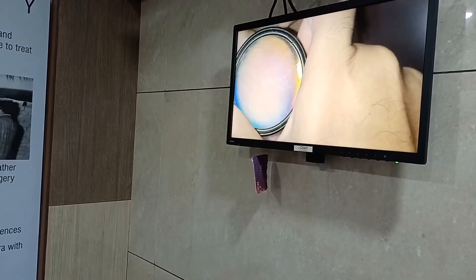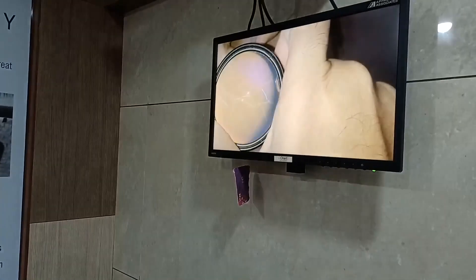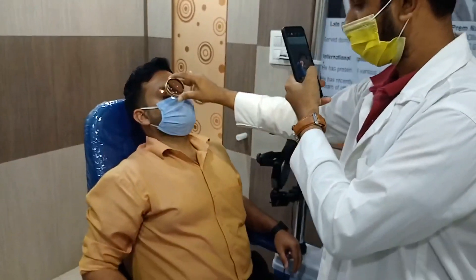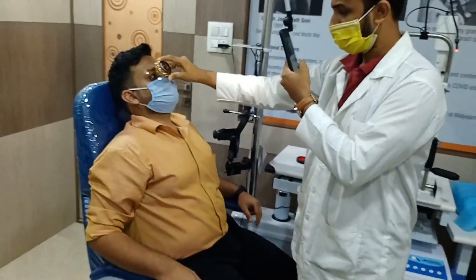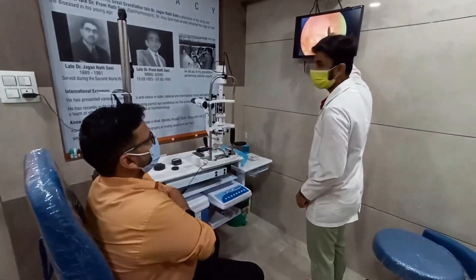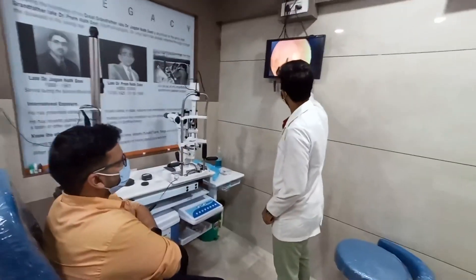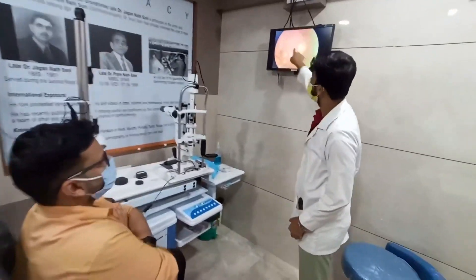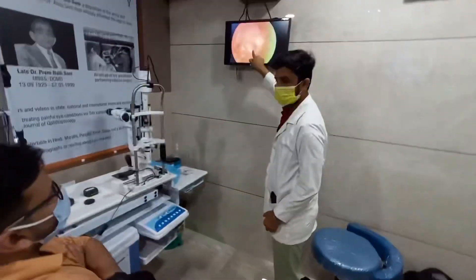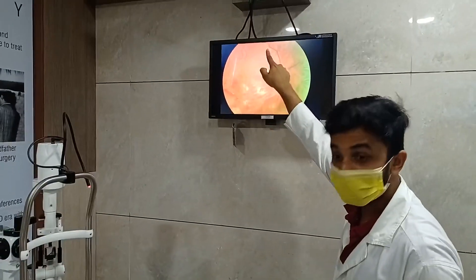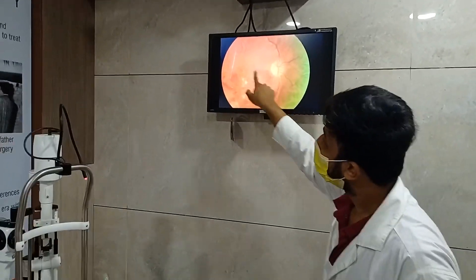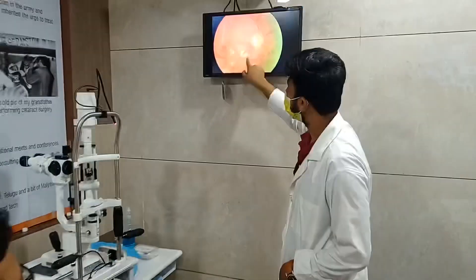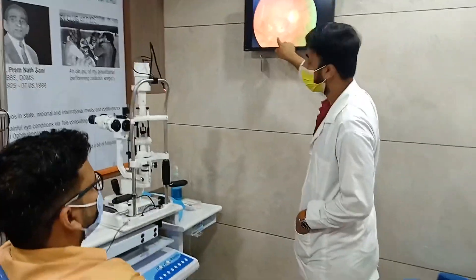Now your fundus videos can be relayed live, and both the patient and relative can see. Even if you don't use a mobile fundus scope, images from your conventional fundus camera can also be used to explain. And all this happens without you moving.